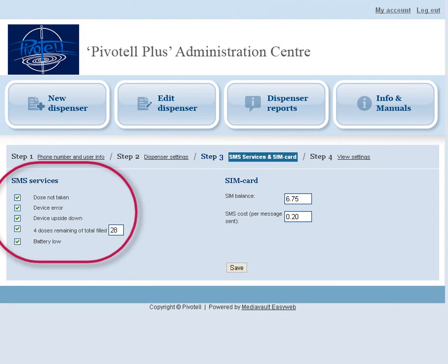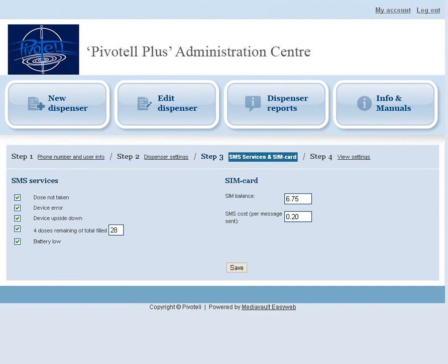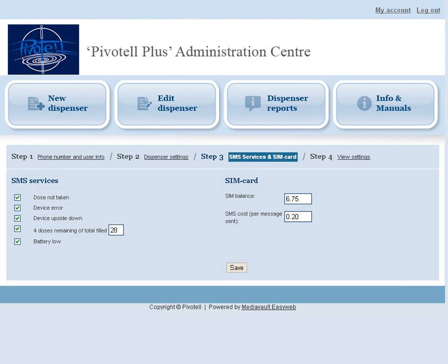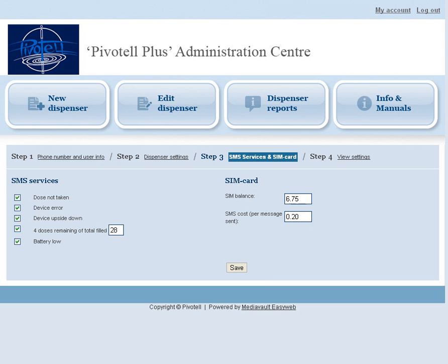Click Save to go to the next step. For SMS services, tick the messages that you wish to be sent. In the SIM card section, enter the SIM balance. A new SIM card will be supplied with a £10 balance, less the dispenser initiating messaging costs. Enter the SMS cost per two-way message sent. This varies according to the operator, but is twice the cost of a standard single message — so for example, if a single text message costs 10 pence, enter 20 pence in this field. Click Save.